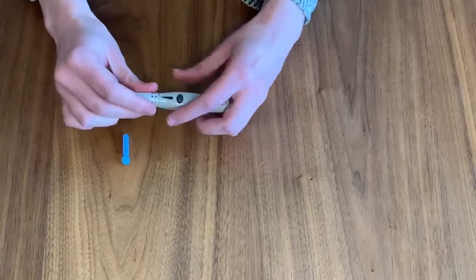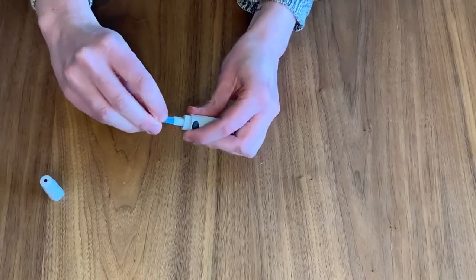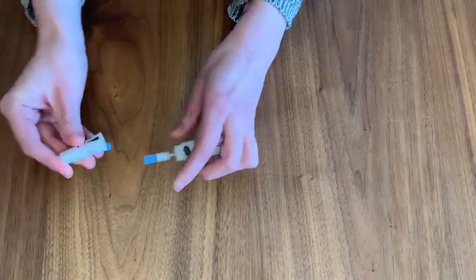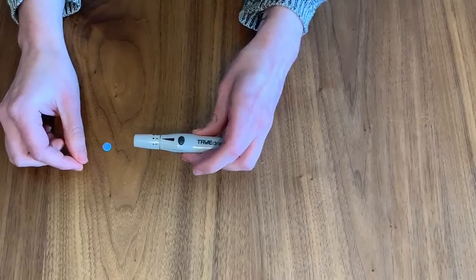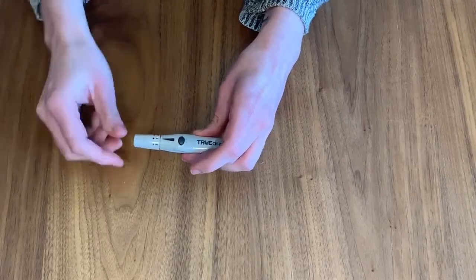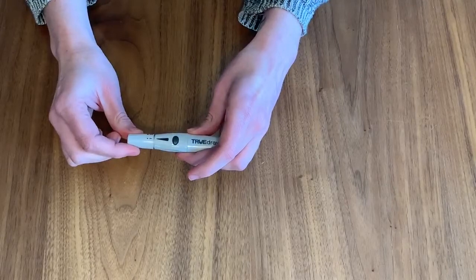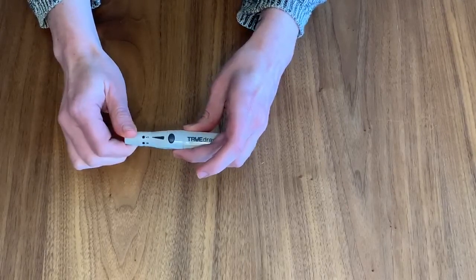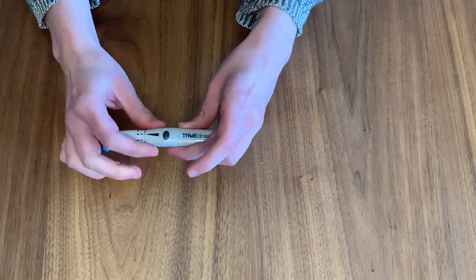We will begin by getting the lancing device ready. Remove the cap of the device and place a fresh lancet inside. Changing lancets regularly will help with comfort. A fresh lancet is sharper and more comfortable to poke your finger compared to a dull one. Then, select the depth you would like to use to poke your finger. Most at-home lancing devices come with an adjustable depth setting. One is typically the most shallow poke, and a higher number provides a deeper poke if fingertips are tough or calloused.